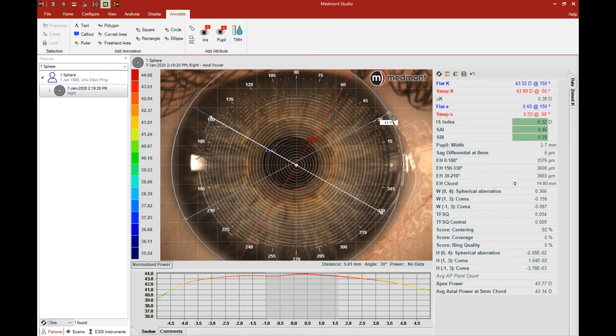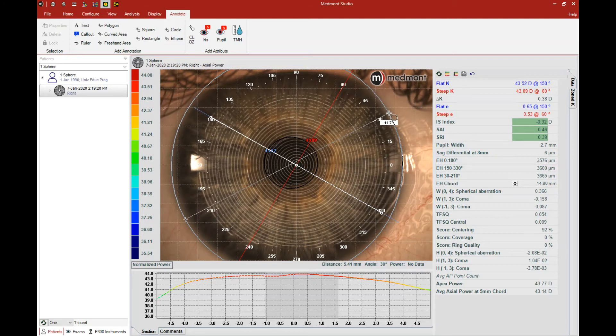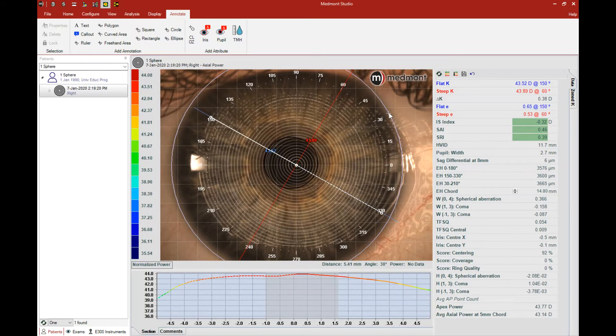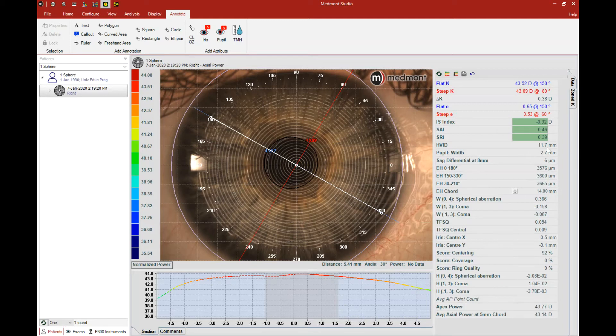Once you're happy with the position of the circle and diameter, unclick the mouse and the visible iris will be automatically defined. In this case, we have an 11.7 millimeter visible iris diameter.